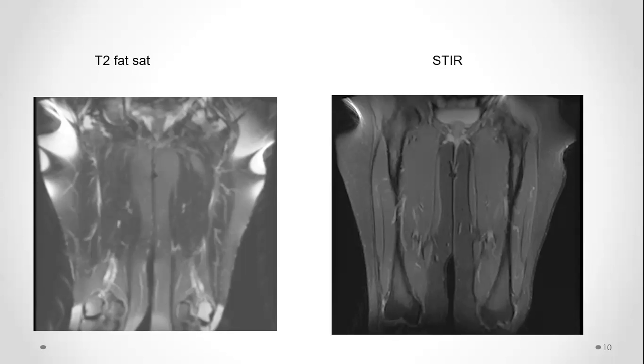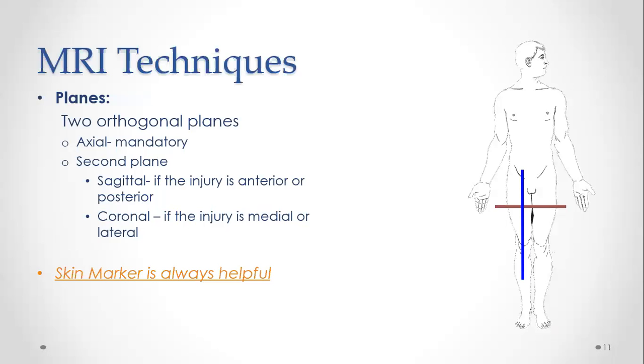So if you were to supervise a case like that and the MRI technologist is asking for your opinion to overcome this problem, you just always prefer to switch to a STIR sequence.